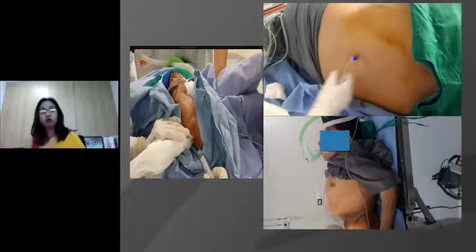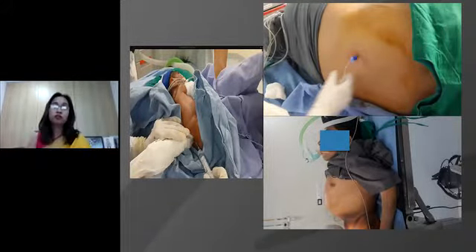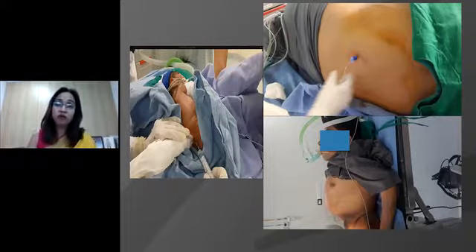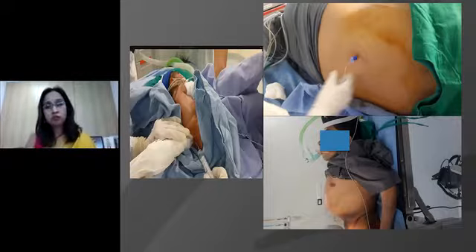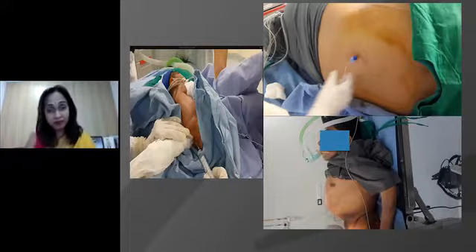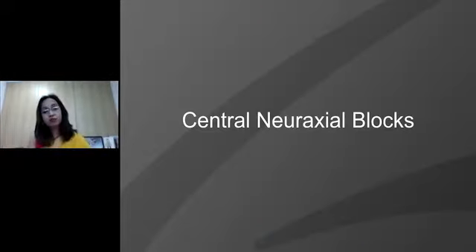So this is a plethora of sizes and various shapes of children that today we encounter. They could be, as I said, as small as 700 grams and as big as 95 to 100 kilograms of an adolescent coming to you. Plus there could be kyphosis, scoliosis, there could be anomalies in the hand, anomalies in the feet, and not to say other anomalies such as cardiac, such as other systemic, any systemic anomaly for that matter. But let's come to the central neuroaxis block, because this has been here for years together, and then we shall soon later on move to peripheral blocks as well.